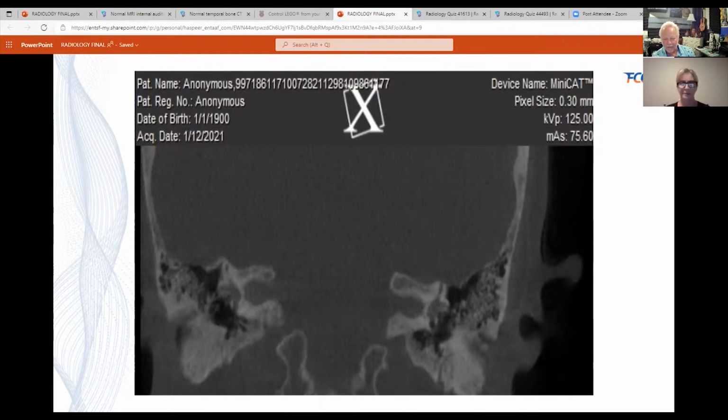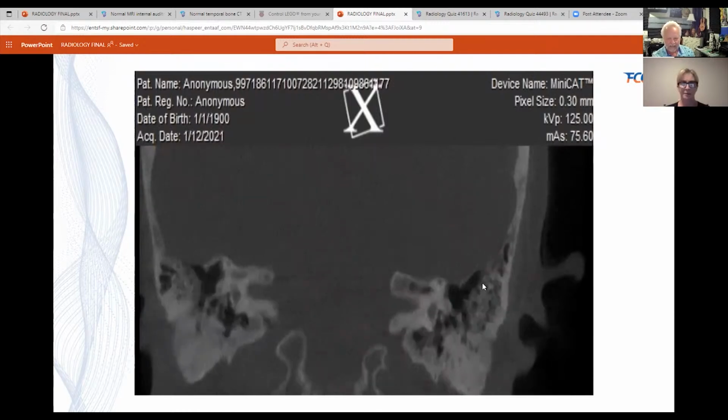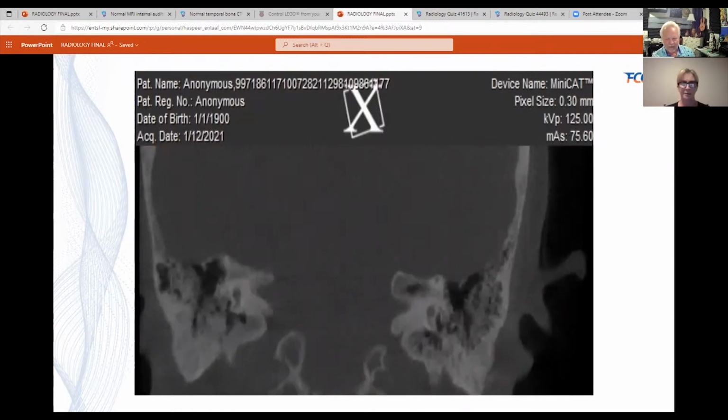And whenever I see conductive hearing loss and am thinking stapedectomy, which is a surgical procedure for repairing conductive hearing loss, I always get a CAT scan to look for this, because if I see it, the surgery is likely not going to work. You can see as we get back further, now there's bone over it, but we always look for that. And there's a little bit of it on this other ear, on the right ear as well.